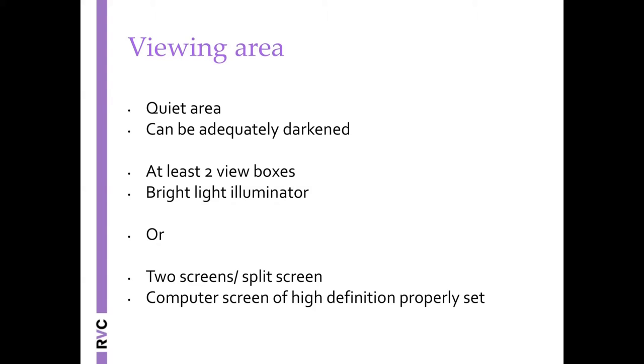When we look at radiographs we need at least two view boxes. We are going to use two orthogonal views—it's a three dimensional world. We need two views to identify where whatever we see is in three dimensional reality, and we need a bright light illuminator so we can see the darker areas of the radiograph.